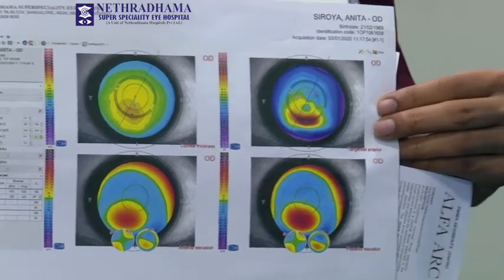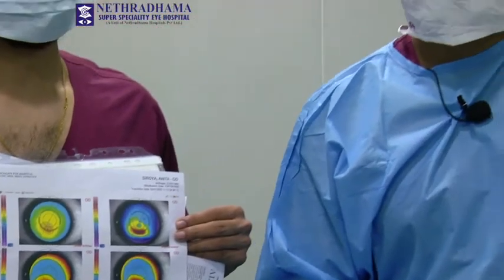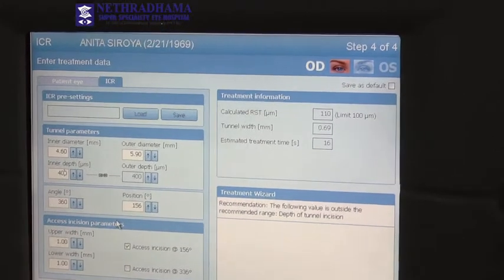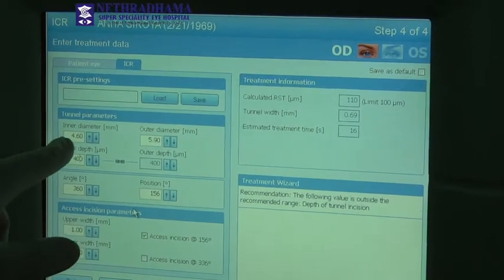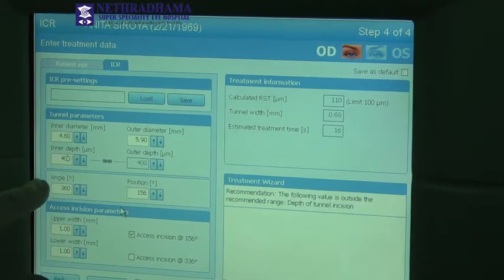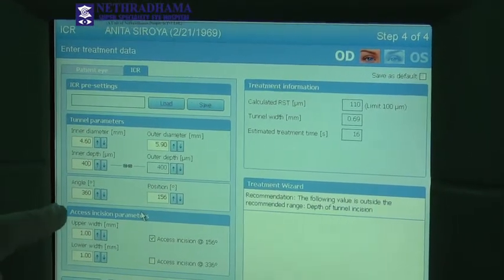We'll go on to the machine and I'll show you the details in the Visumax. We're going to use the Visumax femtosecond laser to make the channels and then implant the ring. This is the screen for the ICR on the Visumax. The ICR is placed at a 5mm zone. The inner diameter is 4.6 and the outer diameter is 5.9, and this is the inner and outer depth and the angle.